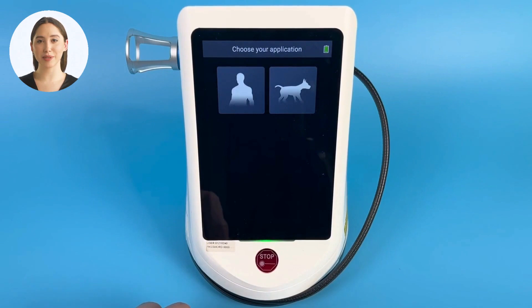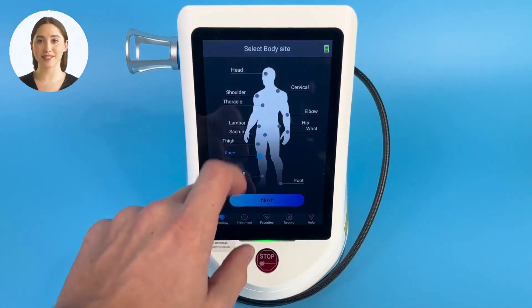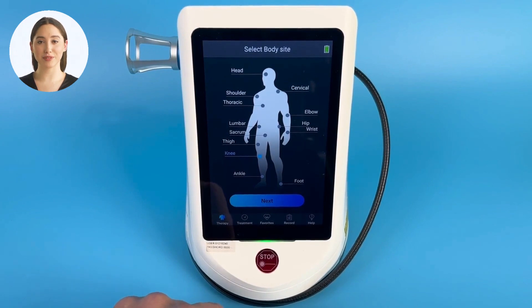Choose your application by selecting the icon. Today we will be doing human treatment, but all EVO lasers include animal treatments as well.